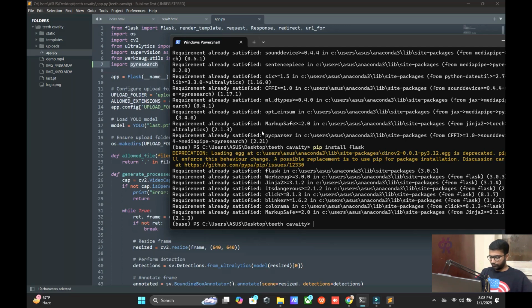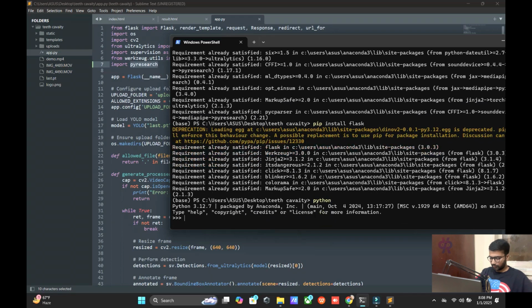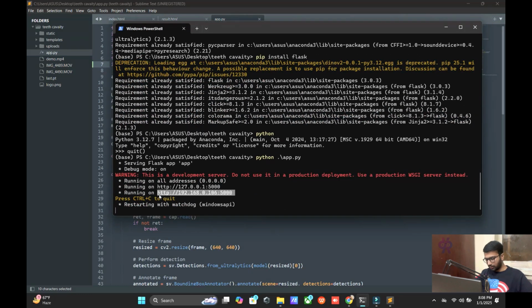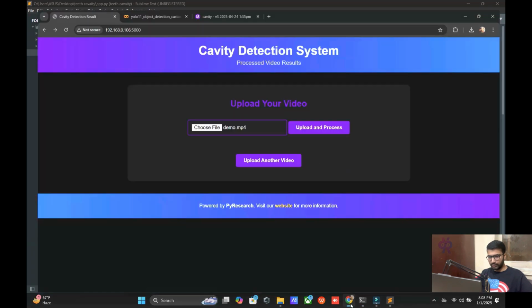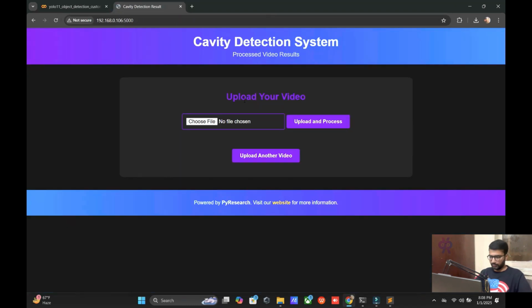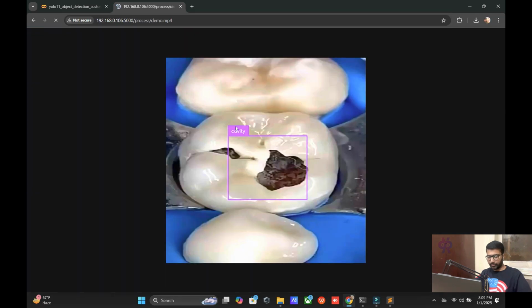Now we need to run Python. You can also see the Python version, and here python app.py. So it's easy for you guys. You can learn from scratch, and you can see we successfully hit our URL. Now you can see this type of interface first. After that, you just upload your video and you get the result. Okay, it's easy for you guys, and you can see the cavity will be detected.